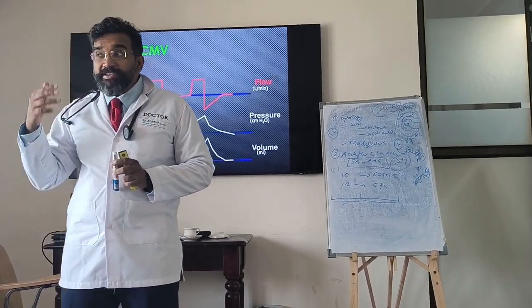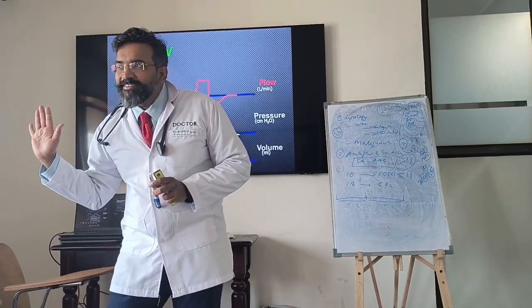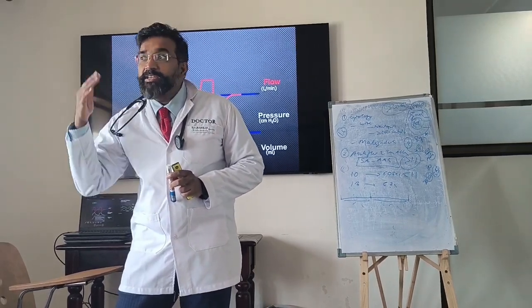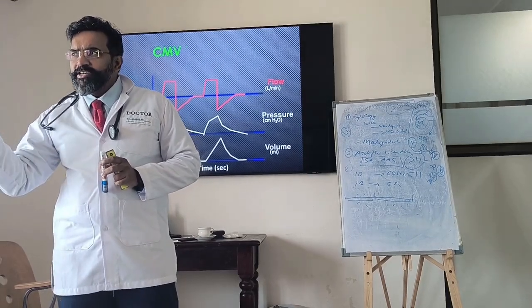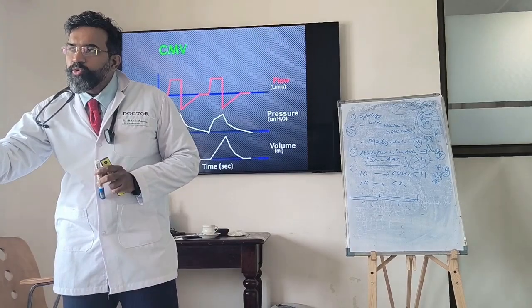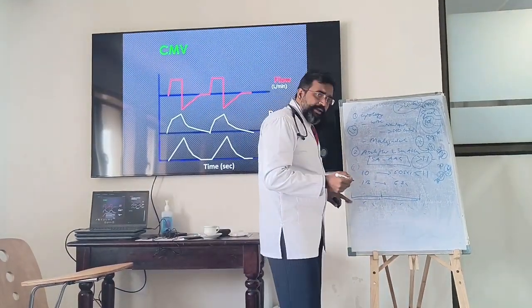Then you have patient. Time is completely machine. The second trigger is patient. The patient might change the pressure or the flow. I'll explain to you what this is. Now we have the time trigger here.